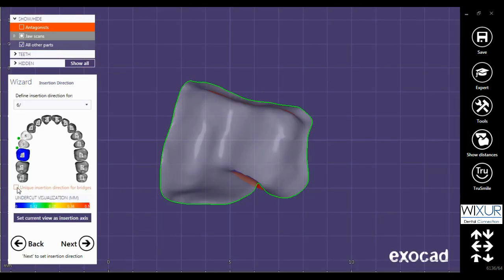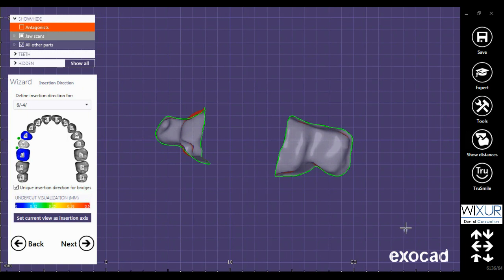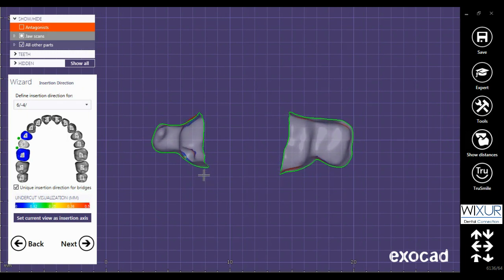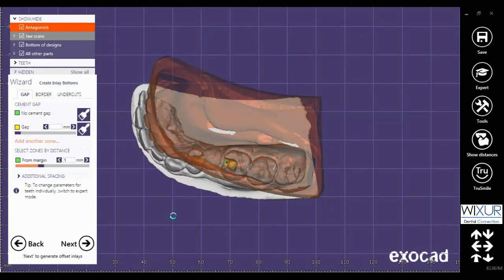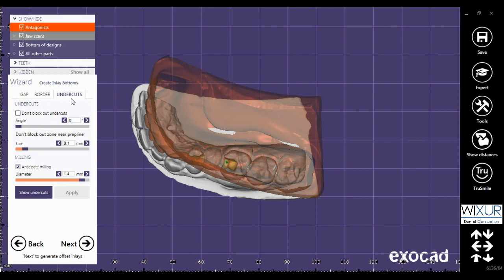Now the next step is to set the insertion direction. Check the box to have a unique insertion direction for the whole bridge. With right mouse click, rotate the job to reach minimum undercut. Click on 'set current view as insertion axis' and click next. Set the cement gap, and in the undercut tab change size to 0 for better placing. Next.